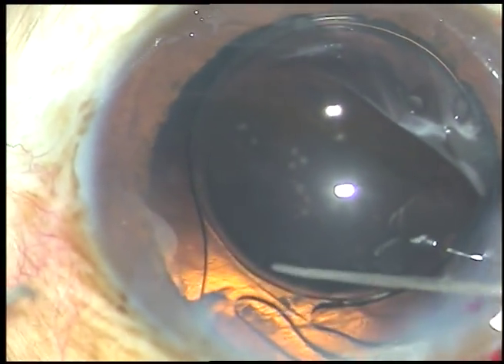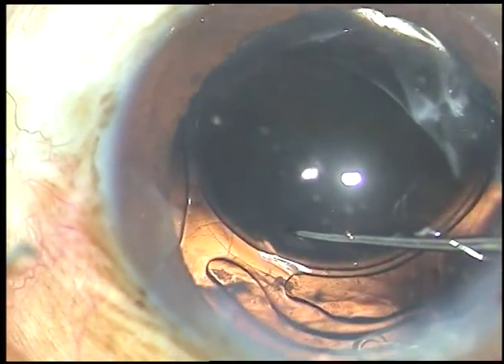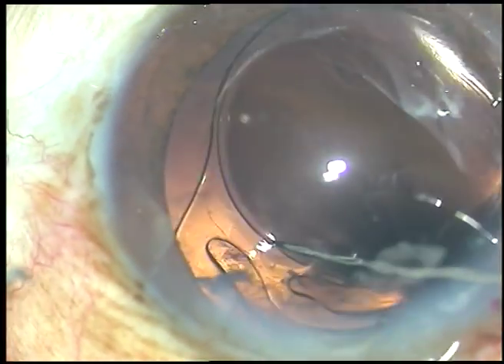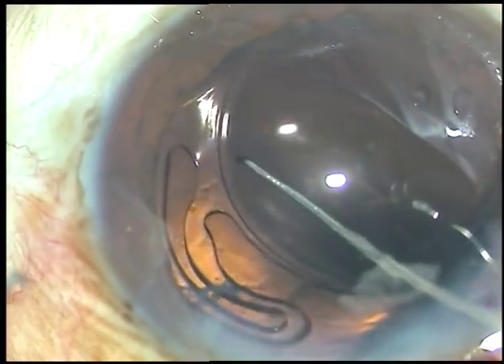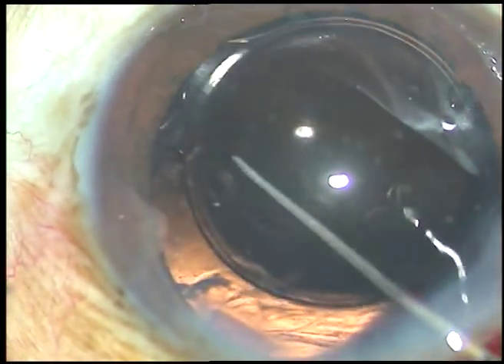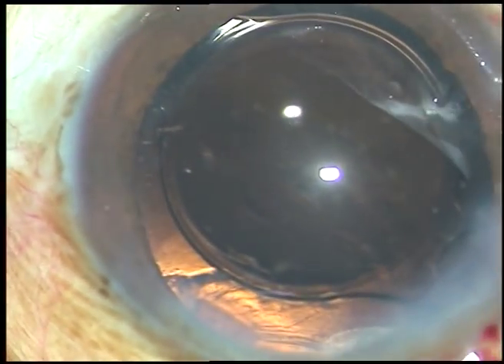I thought that the bag is being nicely supported by the CTR that I have used in this case, so I can dial the lens. I dialed the lens and kept the haptics at 11 o'clock and 5 o'clock meridian.